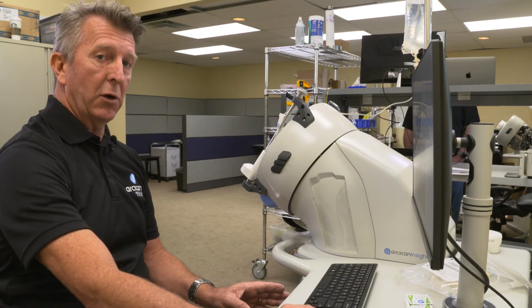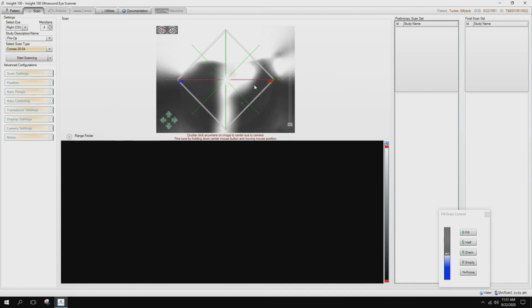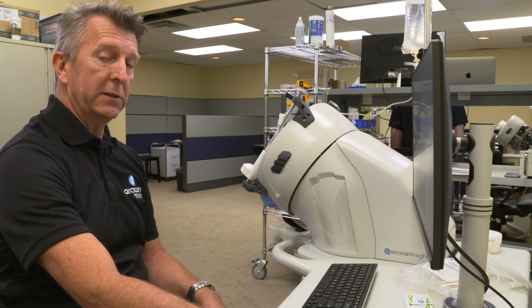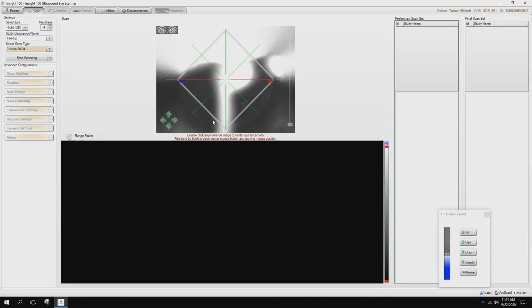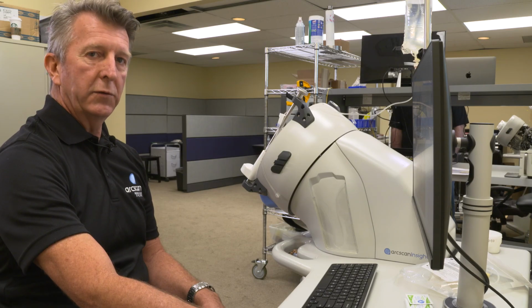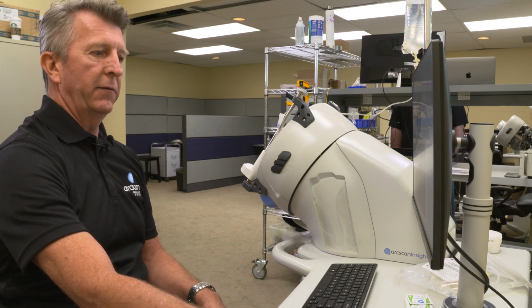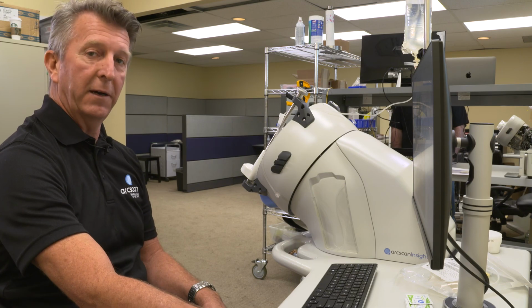Once the patient is on the instrument, in this window here, you would clearly see the patient eyes. And we have other videos available to you to talk about patient positioning and what you should see in this monitor that are covered in depth on those videos. Once the scan is complete, all of your images are here. Again, we will cover those in separate videos. But this is the basic startup of the system, filling the fluid levels, draining the fluid levels, etc. I hope that is helpful.